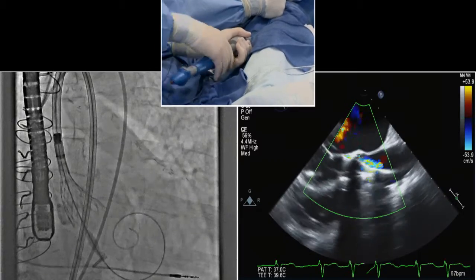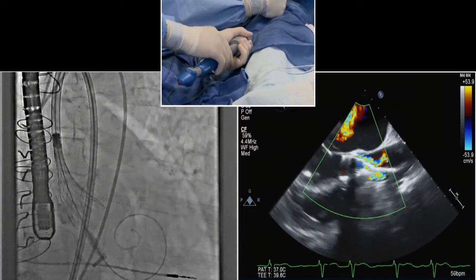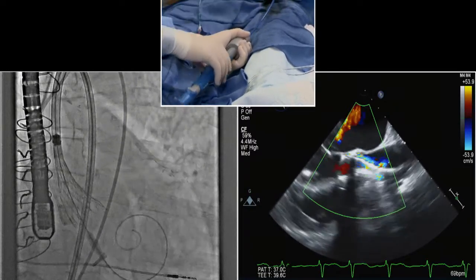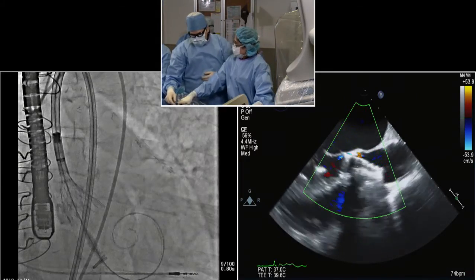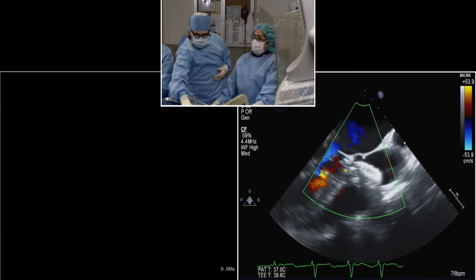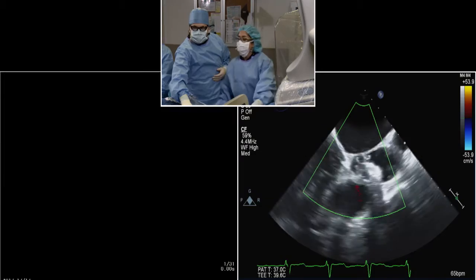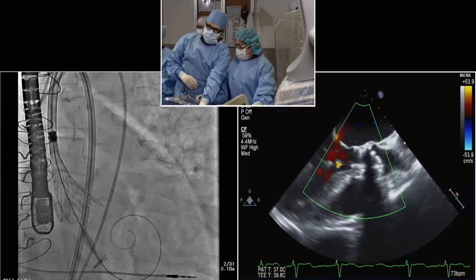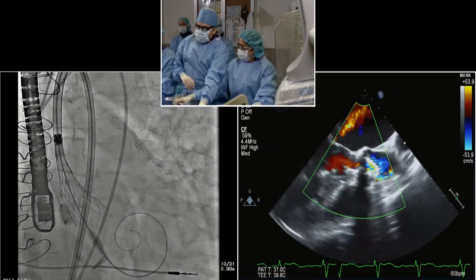Pressure's down, keep going. The other thing that we see is that this mechanical valvuloplasty that you're actually performing sometimes helps you out. Even if you redeploy the valve at the exact same angle and height, you may have changed the interaction with the anatomy. Even not changing the height of the position, that mechanical valvuloplasty with the device actually helped improve some PVLs. We've seen that as well. Wait, wait, wait. Wait, resume.